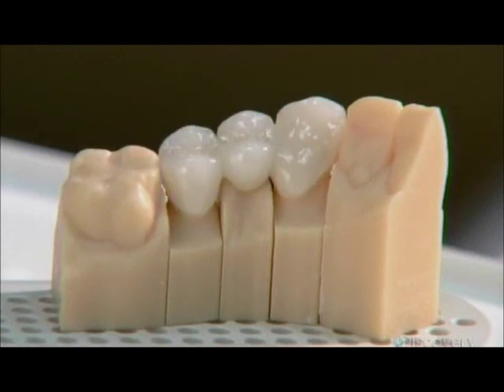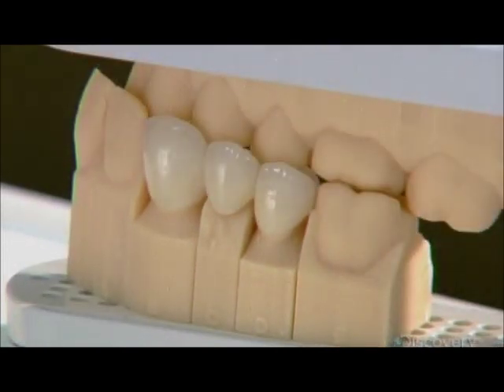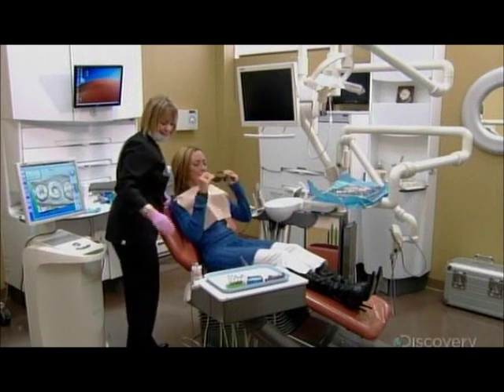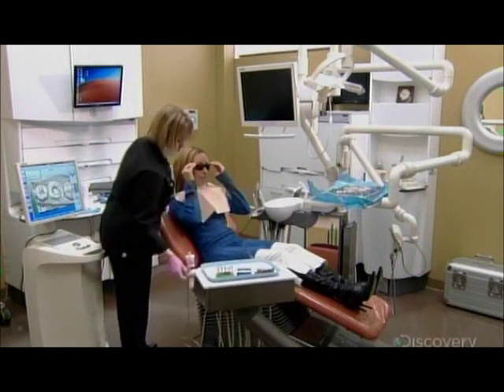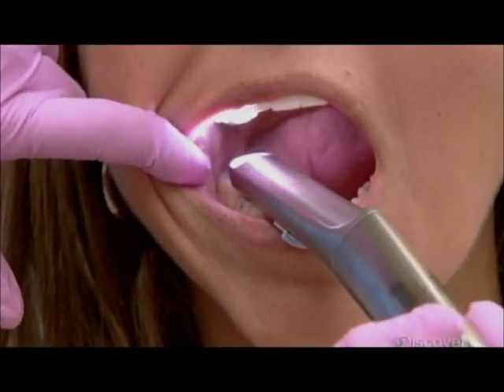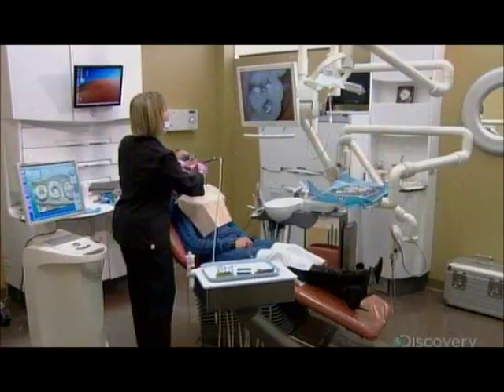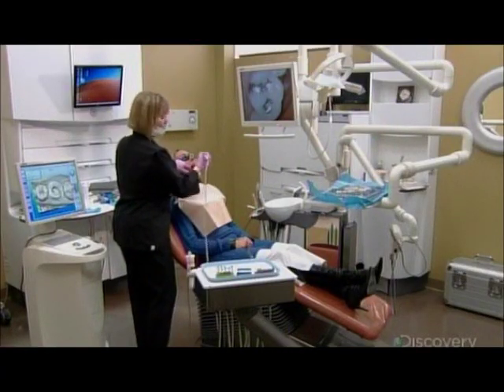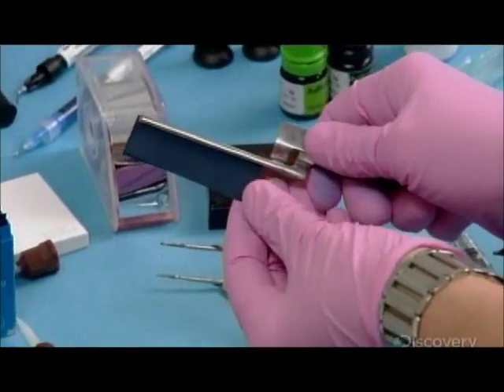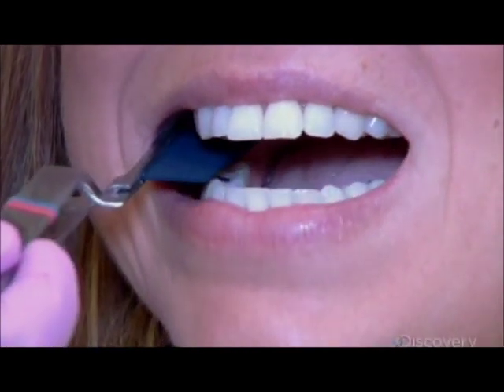With computer-driven tools, custom restorations take shape in a matter of minutes while the patient waits. After donning dark safety glasses, the patient is ready for her close-up. The dental assistant inserts a small video camera in her mouth to examine the problem area. She then inserts a strip of carbon paper between the patient's teeth and instructs her to clench her teeth, leaving markings that indicate her bite profile.